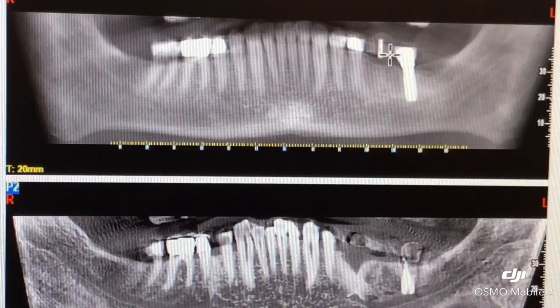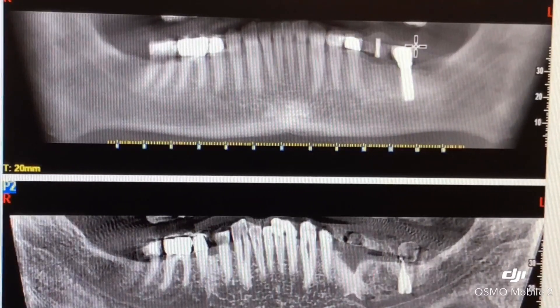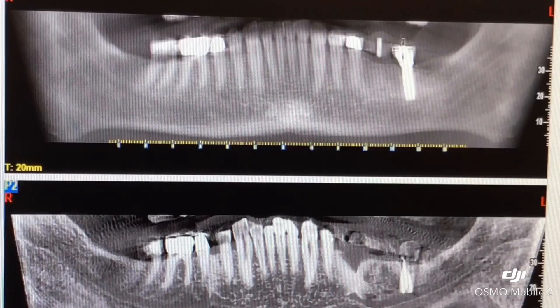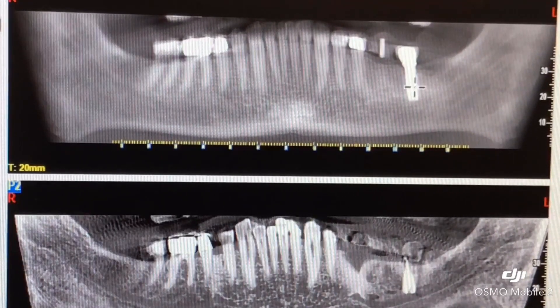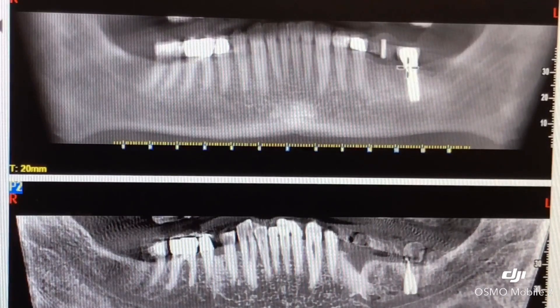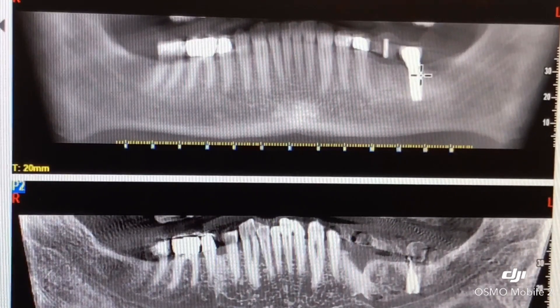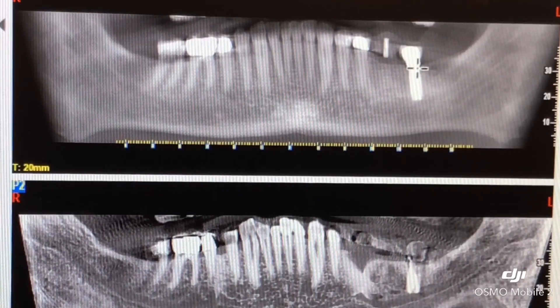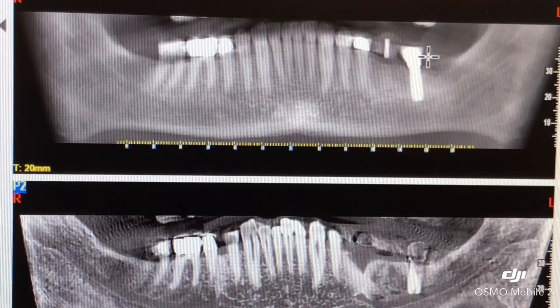This is the CBCT scan, the three-dimensional scan of the patient. The titanium implant — this crown here on top of the implant was loose. The screw had failed because there was a tiny fracture in the housing, in the hex, but the implant was quite stable.